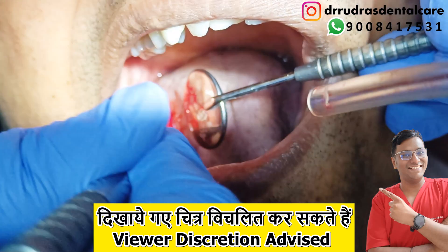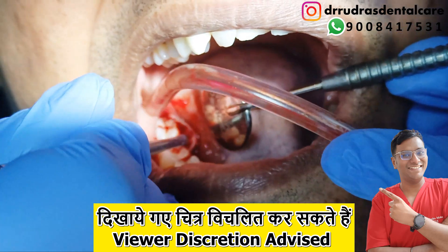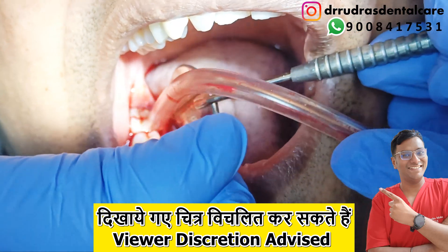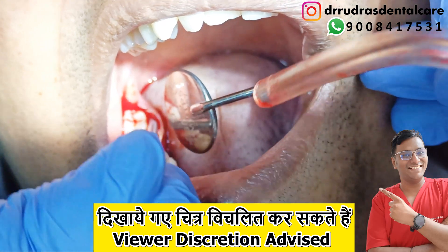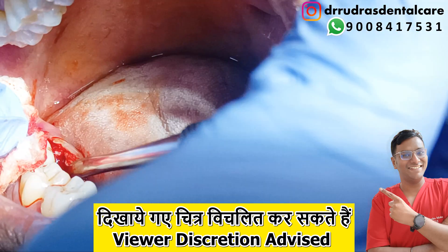After the mucoperiosteal flap has been raised completely, we make sure that we localize the area where we have to operate and visualize it as cleanly as possible to identify the bony spicule and shave it off with the help of instruments.